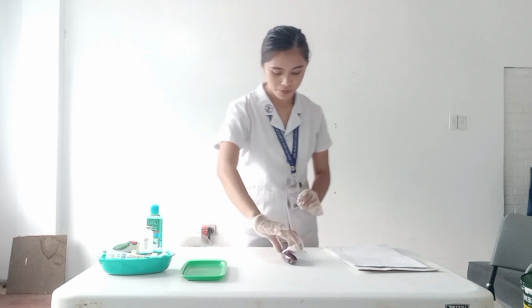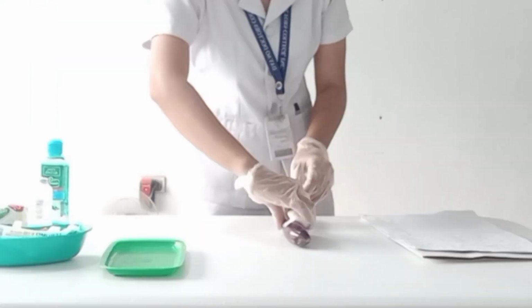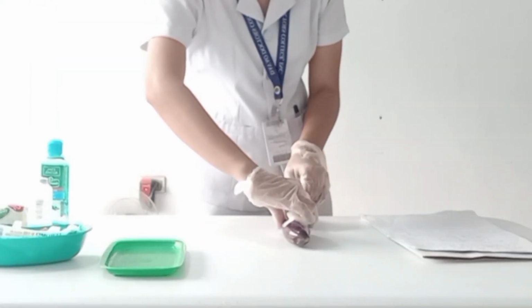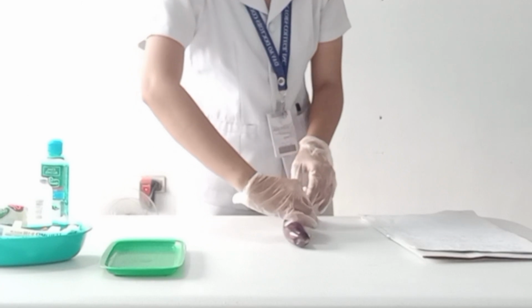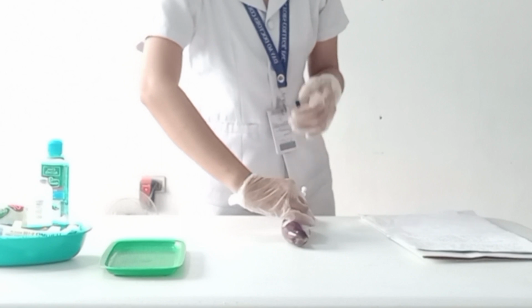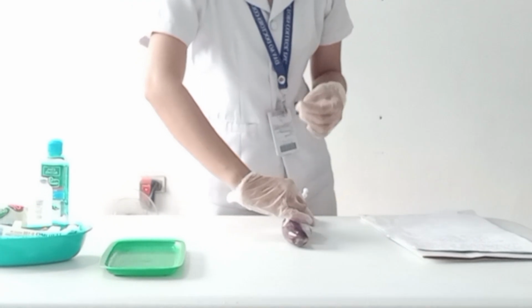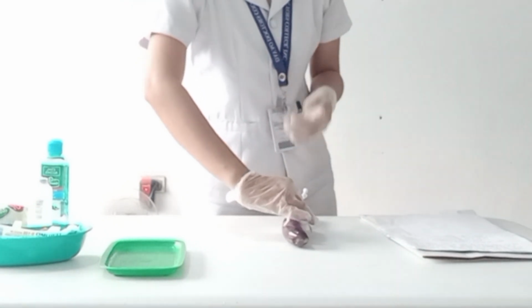Now using the non-dominant hand, pinch or spread the skin at the site and insert the needle using the dominant hand with a firm steady push. When the needle is inserted, move your non-dominant hand to the end of the plunger. Now inject the medication by holding the syringe steadily and depressing the plunger with a slow and even pressure. Holding the syringe steadily and injecting the medication at an even pressure minimizes discomfort for the client.